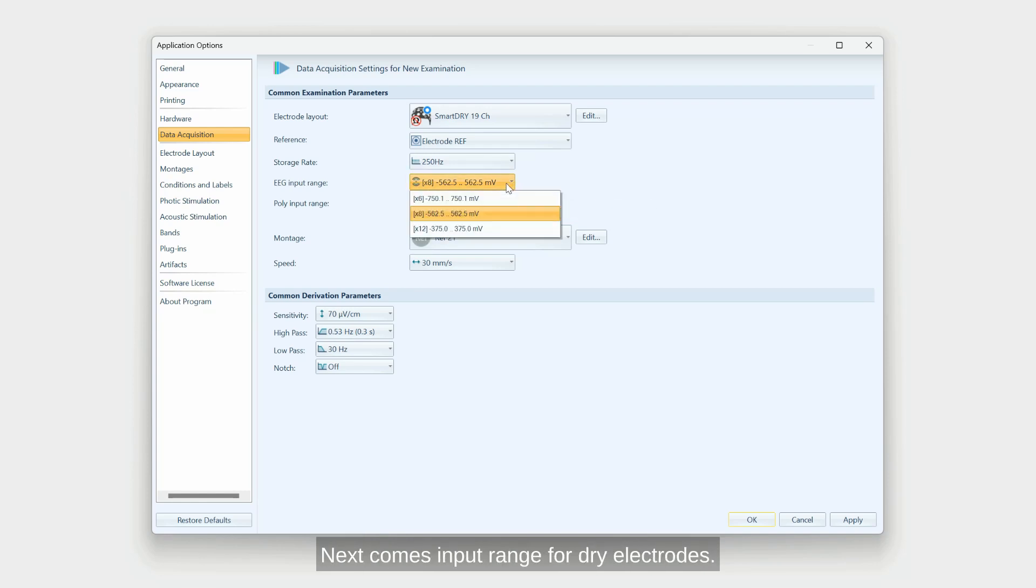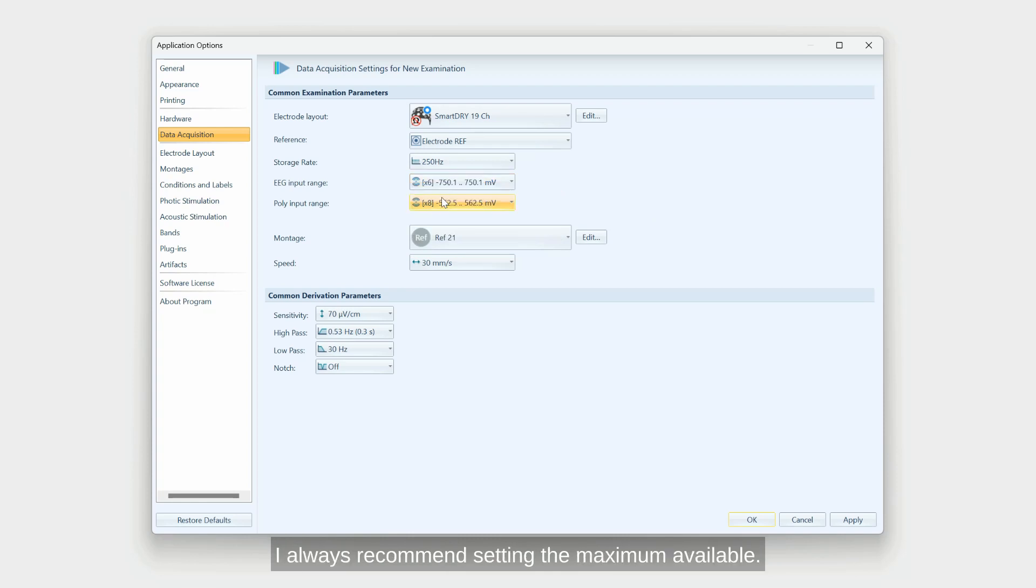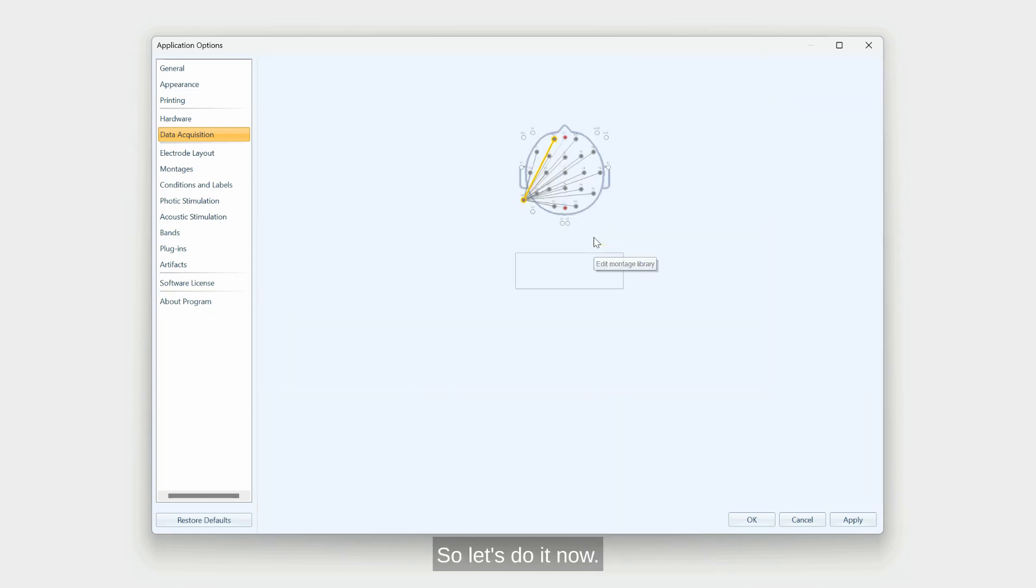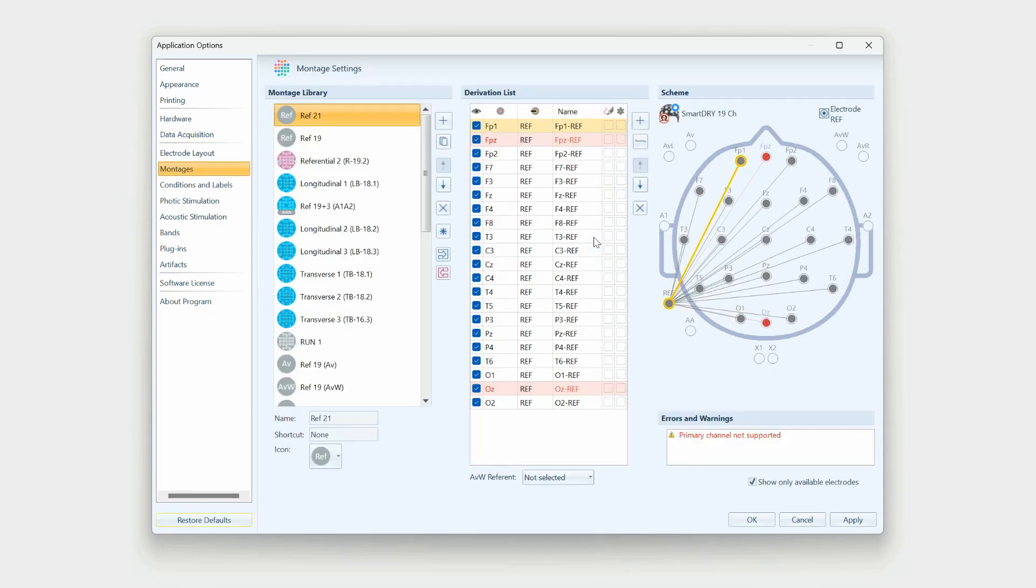Next comes input range. For dry electrodes, I always recommend setting the maximum available. Here you can select your default montage to begin records with. You can always click edit to customize it. Let's do it now.